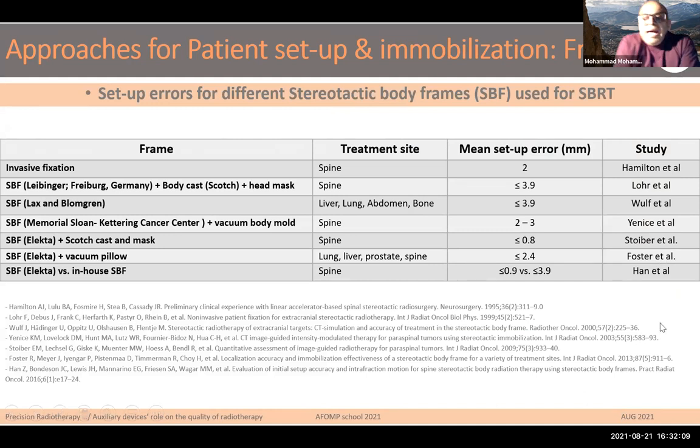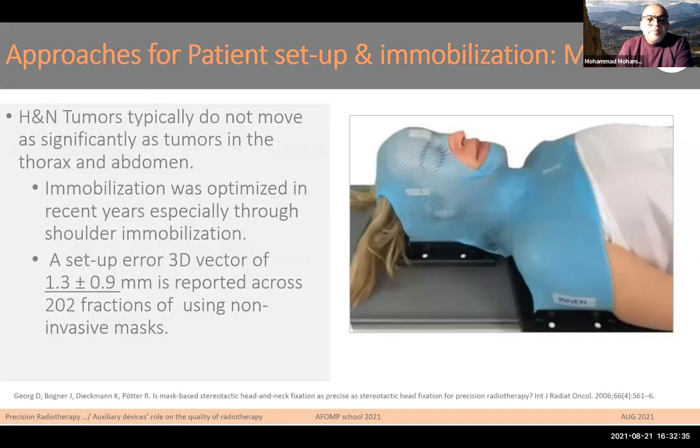Here you can see, for example, SBF fixation or invasive fixation frames for spine, liver, lung, abdomen, and bony markers, bony areas. The highest margin and setup error, because margin is correlated strongly with setup error, is less than 4 millimeter. It's a really great achievement compared to others that said it was around 10 millimeter before.